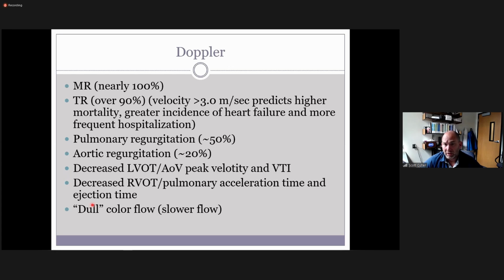And sometimes the doctor will tell you, I want this. When you go to an ER, or you're looking at a lot of your hospital patients, they order a full echo, but all the provider wants to know is what's the ejection fraction. They'll often be coming to bug you to find out what it is, even though it's not our job to tell them. But that's often what they want to know before they release a patient from the hospital, for example. But you would never give them only that. I would do at least a little bit more than that.